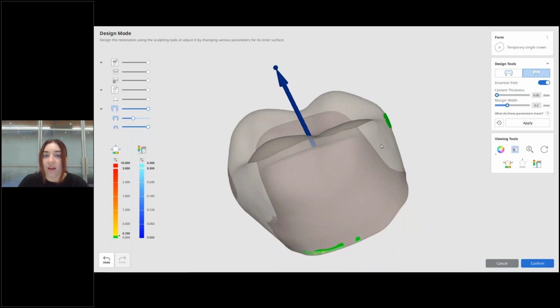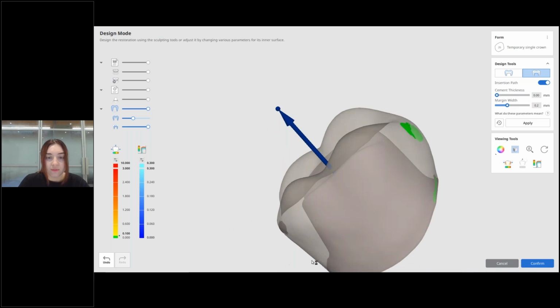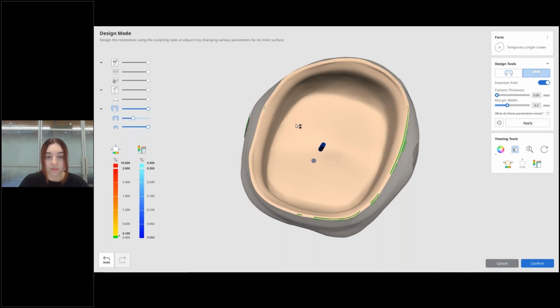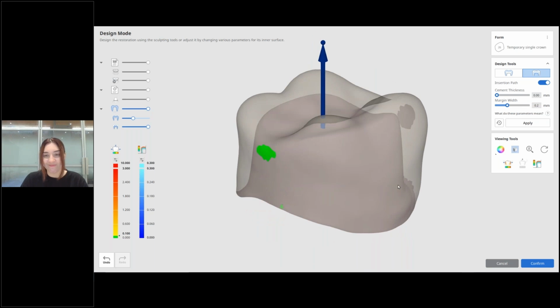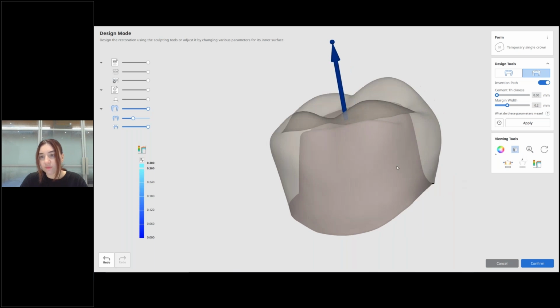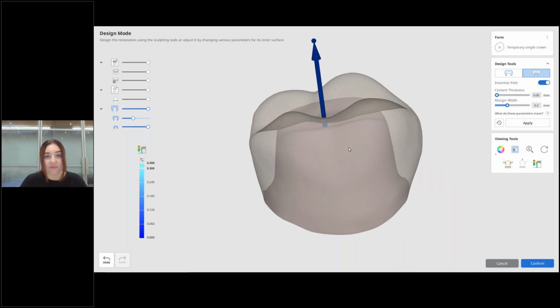I think you bring up a really good point, which is that prior to doing this with the patient in the chair, you should test your settings and make sure everything is set correctly, so you don't have to deal with anything on the tail end if you wanted adjustments. It's good to test everything in the beginning and get your parameters set.